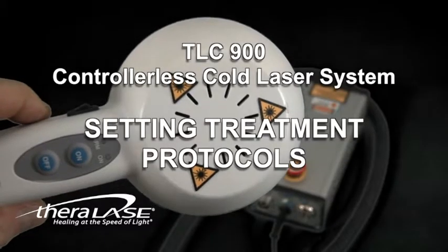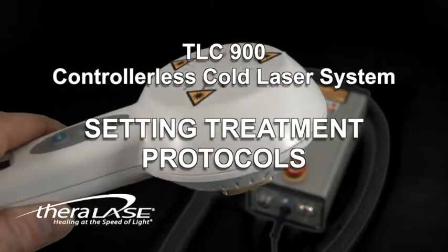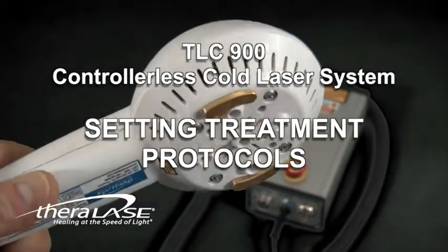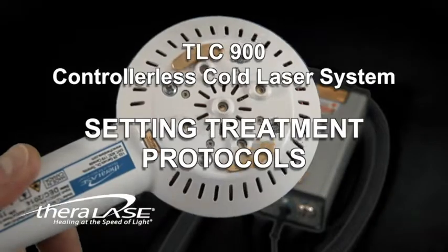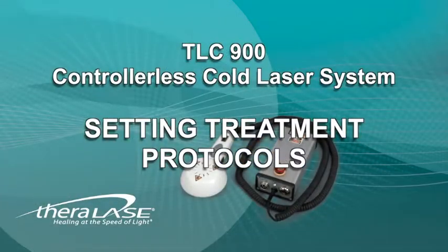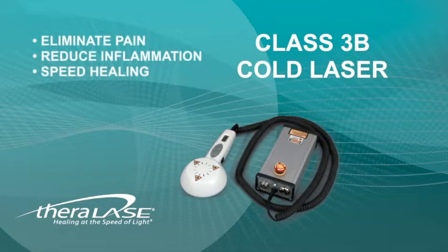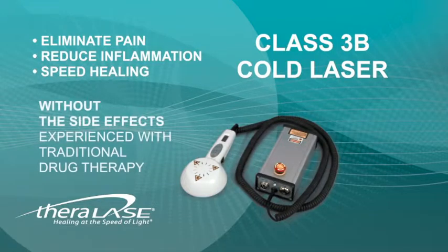The Theralase TLC-900 controllerless laser is a very high-quality, cost-effective medical laser system, available with or without transcutaneous electrical nerve stimulation. This demonstration system is with TENS. In either case, the TLC-900 is a Class 3B cold laser that will quickly eliminate pain, reduce inflammation, and speed healing without side effects.